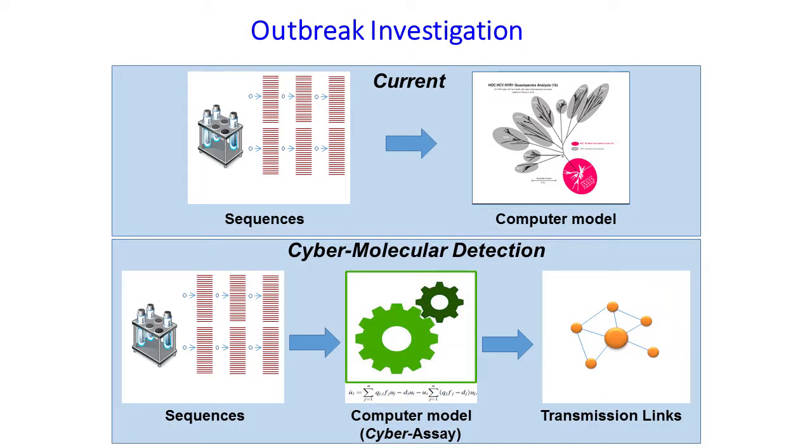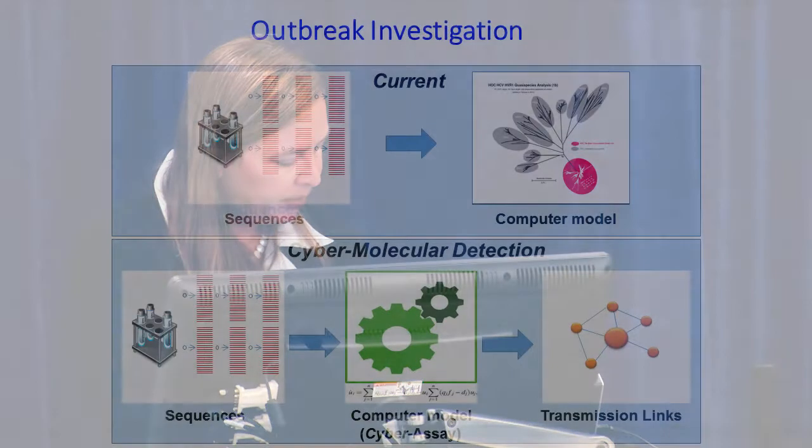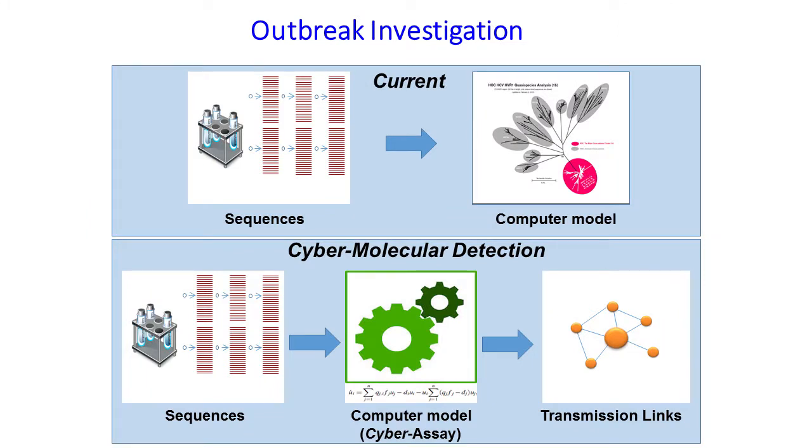Until now, for any outbreak investigation and for determination of any transmission clusters, state health labs would need to send samples from HCV-infected patients to CDC, where we would amplify and sequence the HVR1 region from these samples and use various sequence analysis programs to generate phylogenetic trees, which would require interpretation by expert bioinformaticians to determine if there was a transmission event.